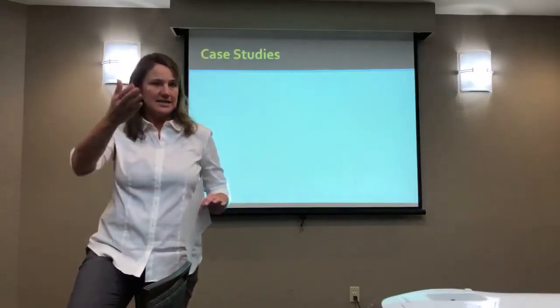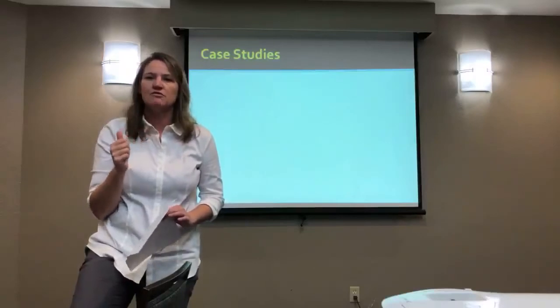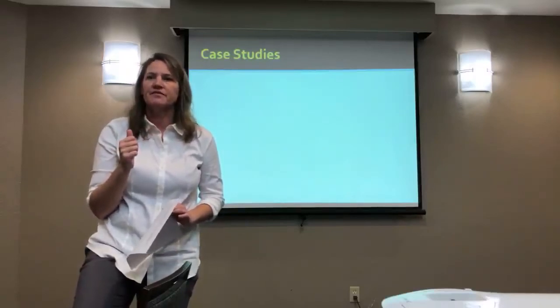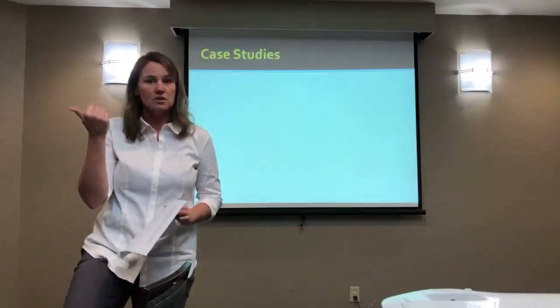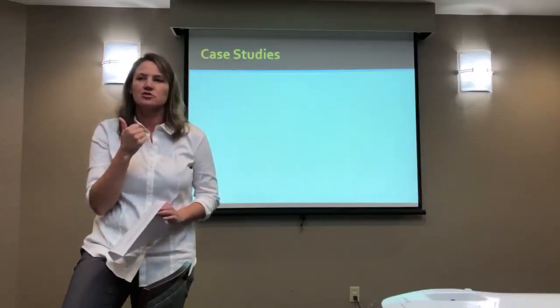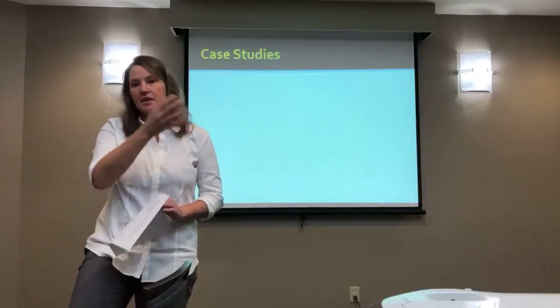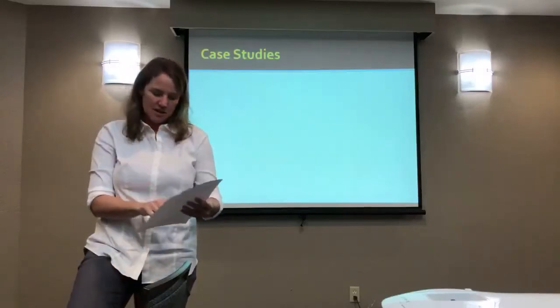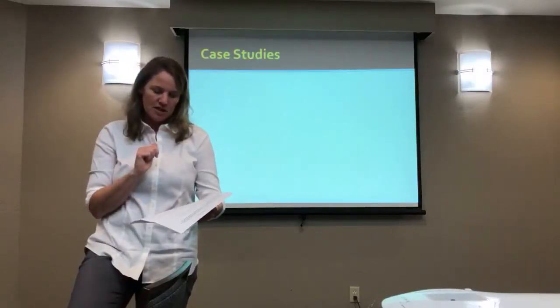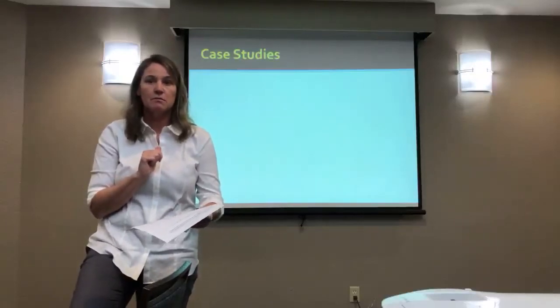Okay, exact idea. So if you're going to incorporate ultrasound, what are you doing it for? Range of motion. Range of motion, but physiologically, heat and stretch. We agree, heat and stretch. Yes, my purpose would be heat and stretch. I think you missed my part about a muscle like the pec minor being tight or something like that. Right. So let's say you have a structure that's tight and you're trying to increase its length. That's what we're saying here: limited external rotation. We have limited motion.